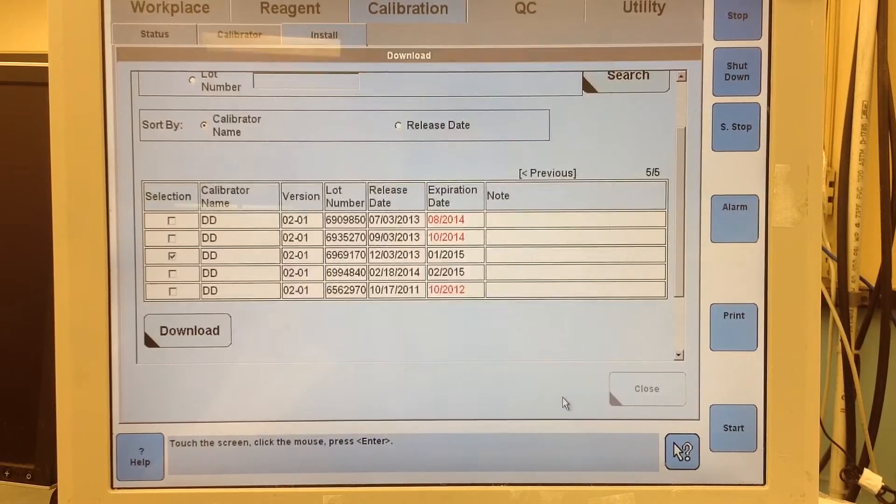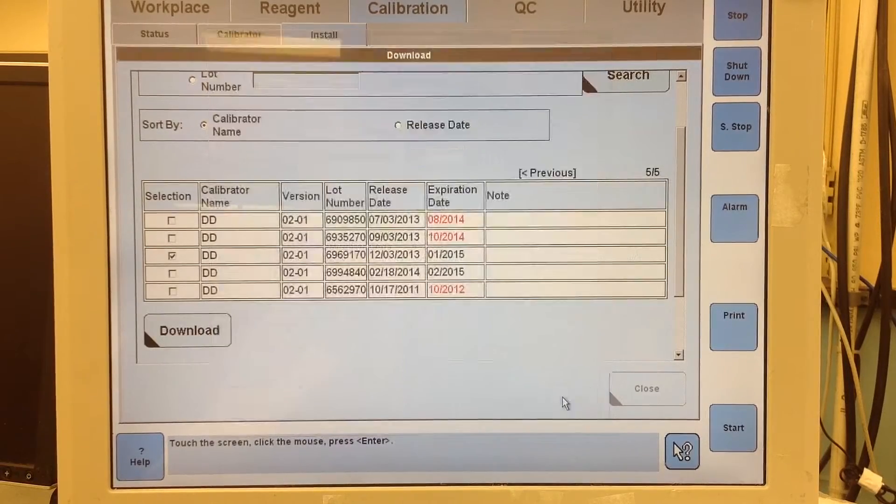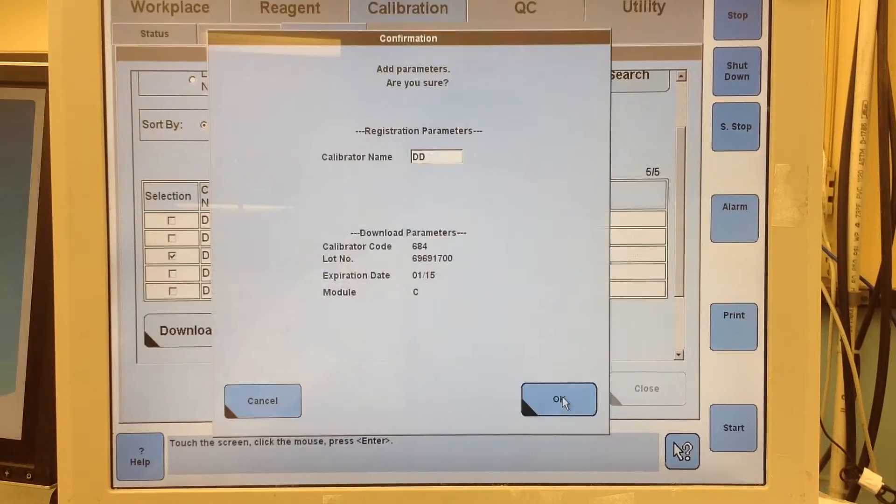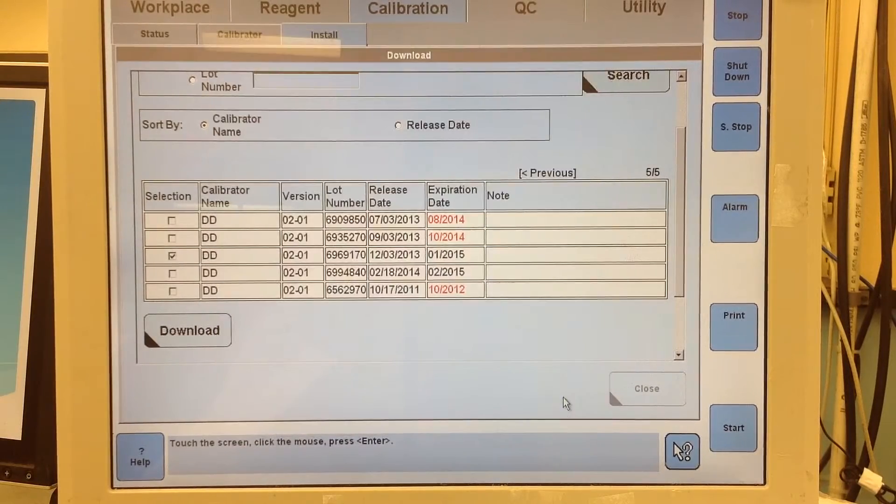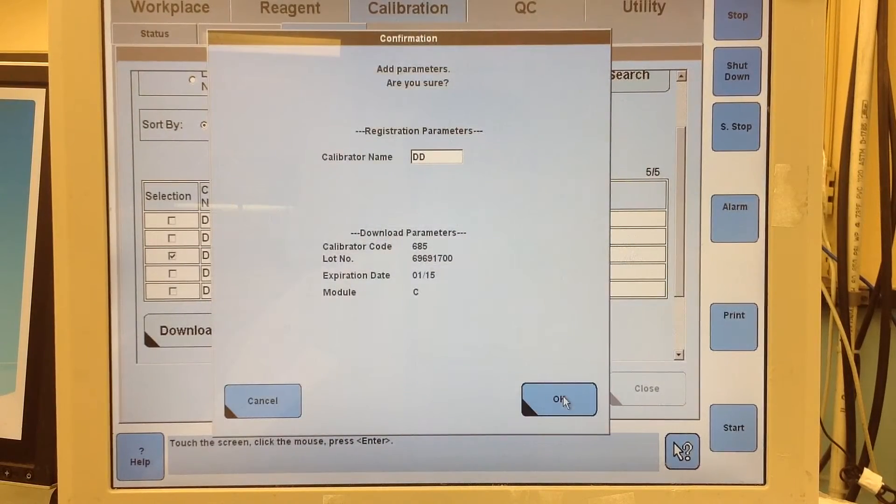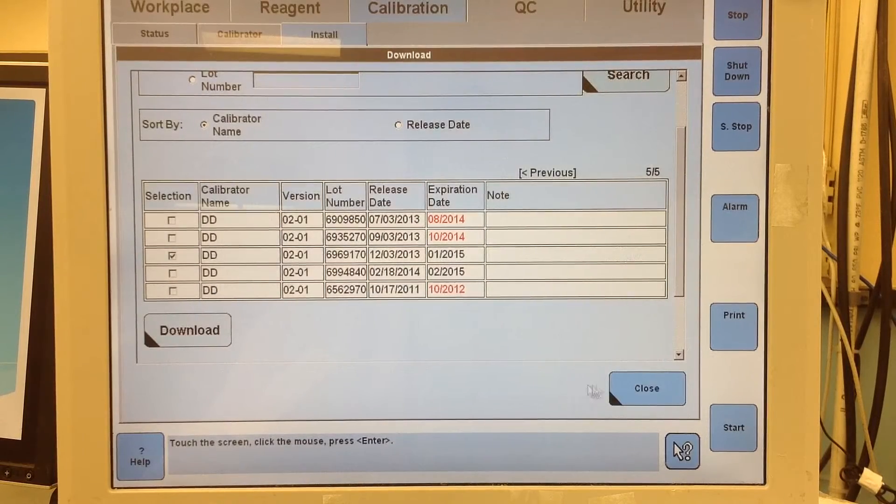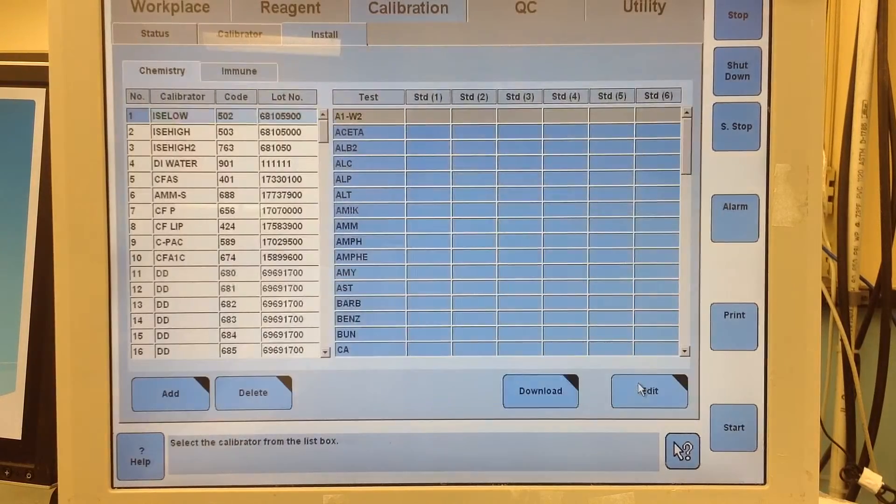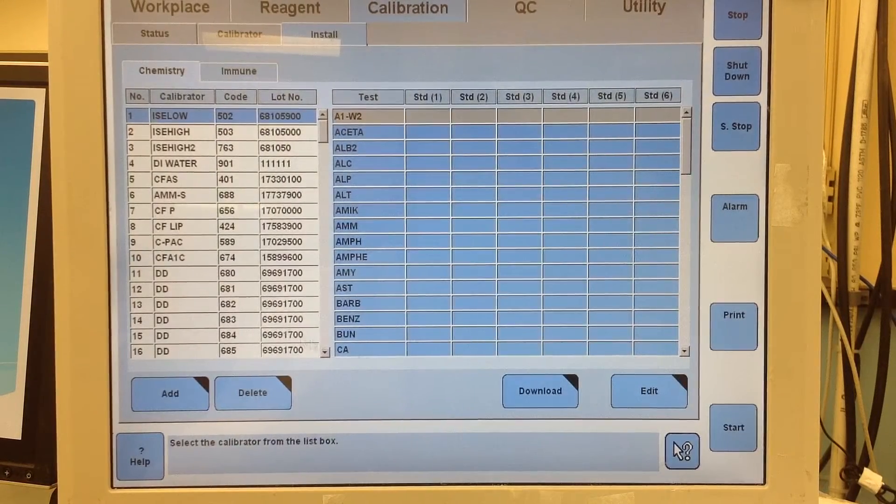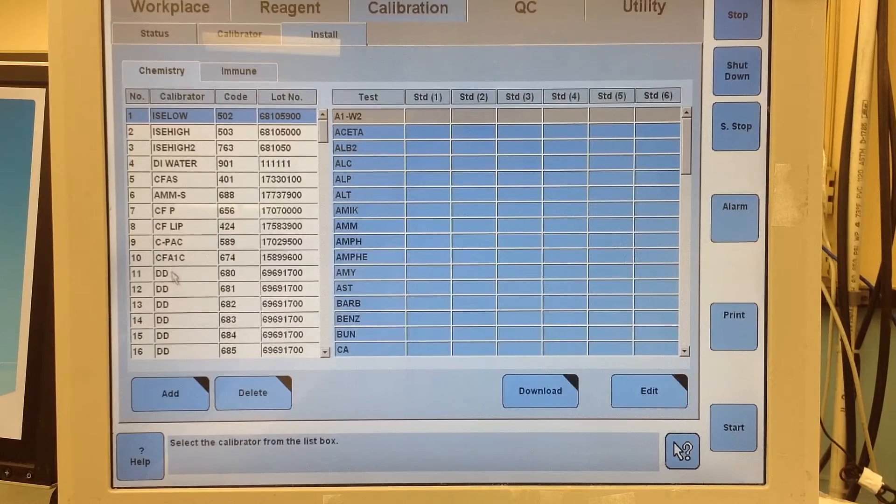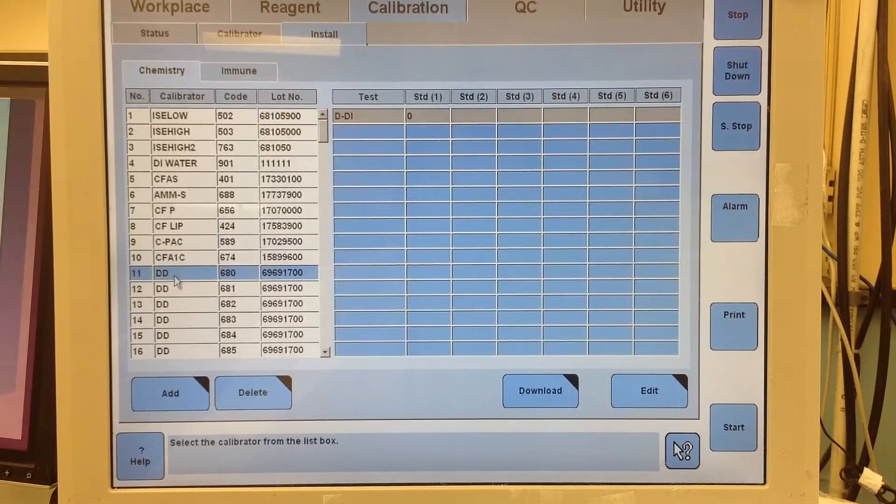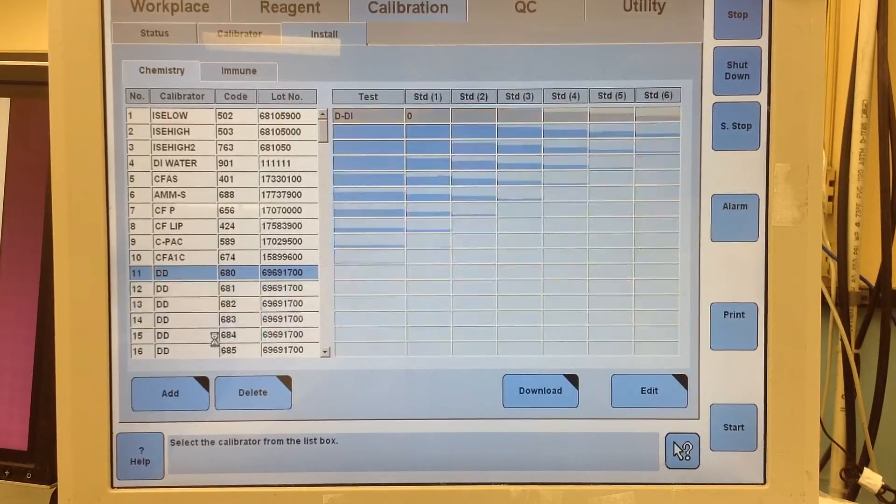So it's going to want to do this for all six. So now it should be downloaded. So we go here and we see where I deleted them earlier. They're all back.